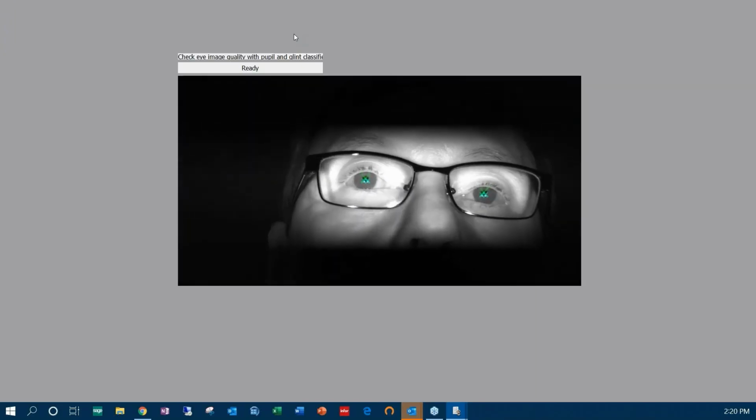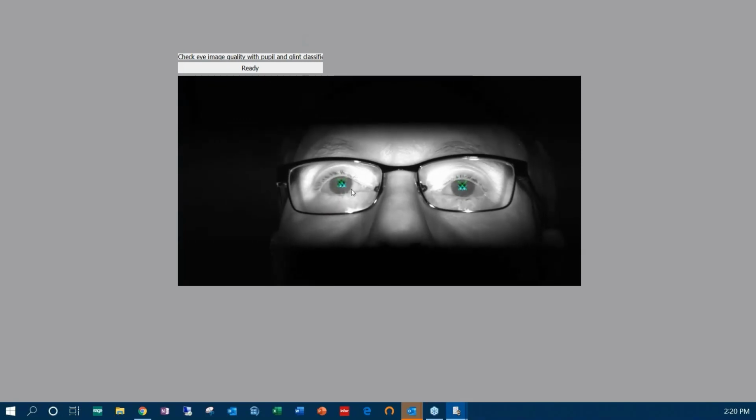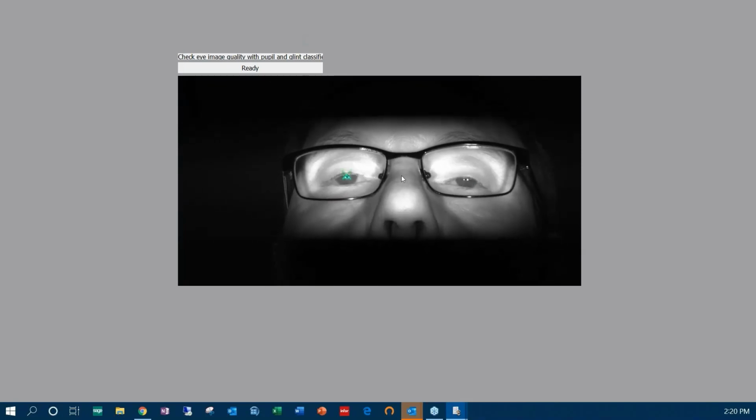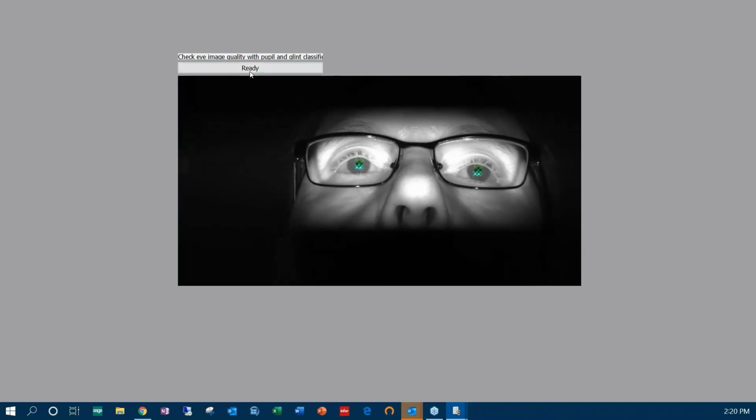And in a moment, we should see a video of my eyes. And this is what the cameras are looking at. They've detected my pupils, and they've put the crosses on there. You can see the two glint points as well. So this all looks good. At this point, I can hit ready.